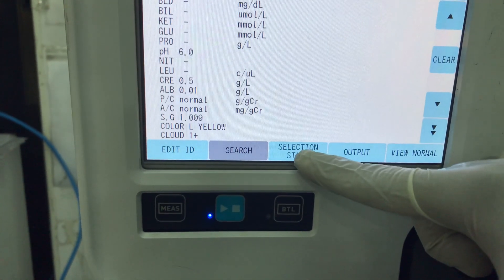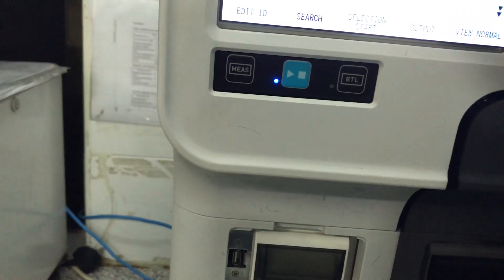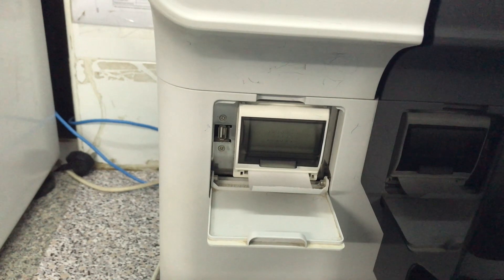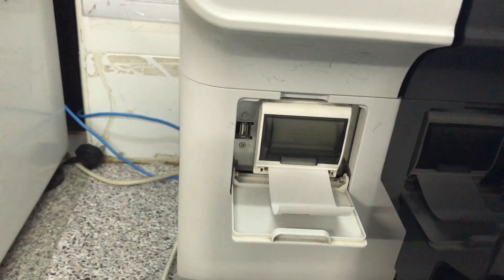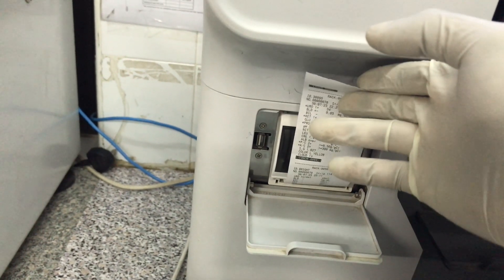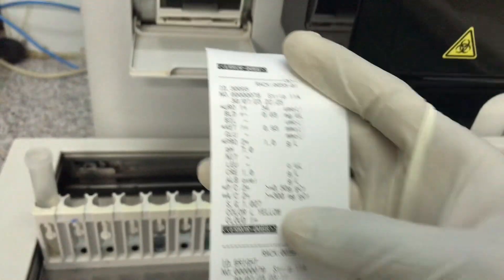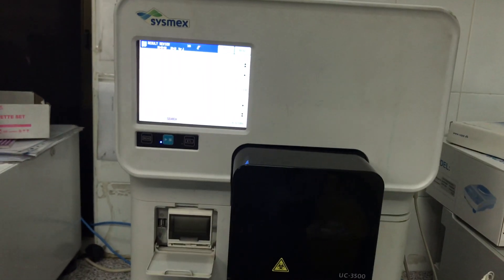If you want to print, you click on selection start and selection end, then output, and it will go to print. You can see it's going to print — and that's your results coming out. So basically that is it. You have your results here — that is how to use this machine.